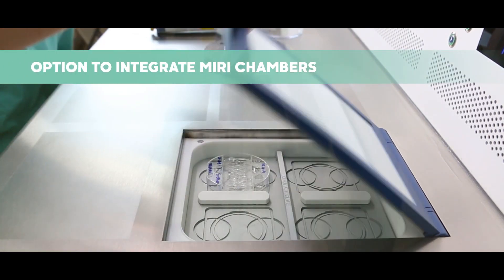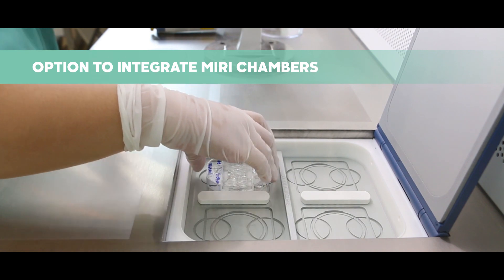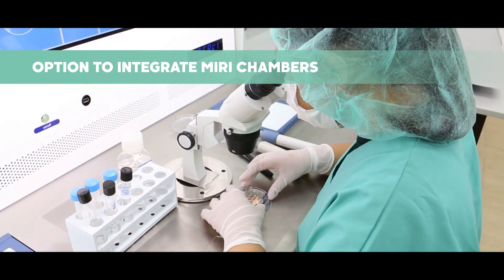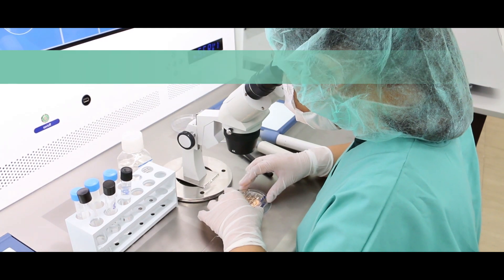The Fertilisafe now has an option to integrate MIRI chambers as temporary shelters for your precious samples while you do your observation and handling inside the workstation.